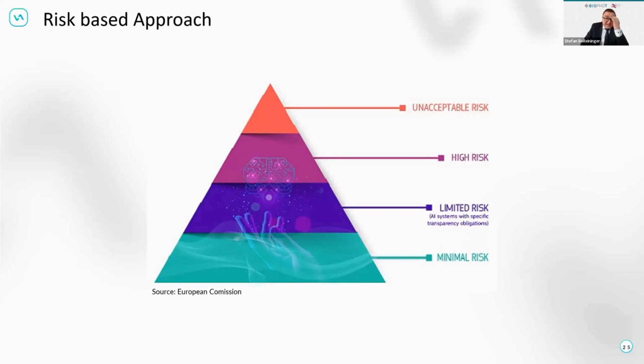Because it's with pre-trained and it has a prediction, deterministic predictions. Then you have a deterministic confidence interval. If you have a deterministic confidence, it actually has no autonomy. It can just decide which kind of calculation it uses. If that's the case, if it's just deciding about which calculation will be used and can transparently build that, in that case, I would say it would be a limited risk product.